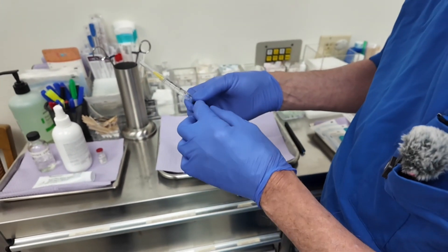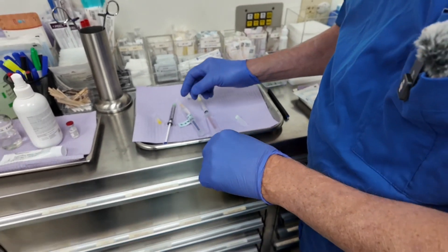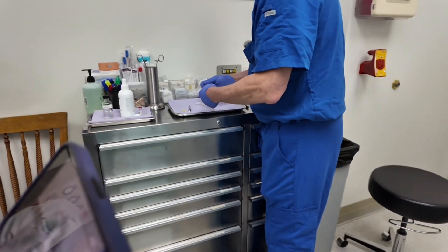Next, I'm going to be injecting this solution — it's a 1-to-5 dilution of lidocaine with epinephrine, and it contains an antibiotic, clindamycin.